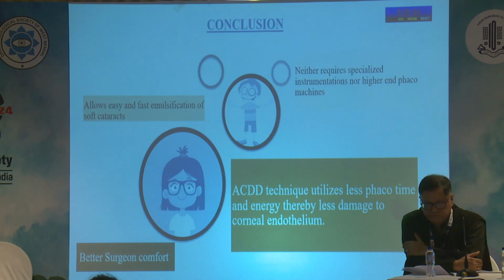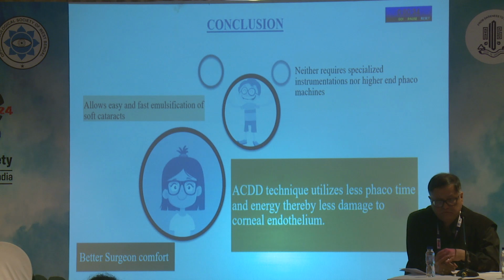To conclude, ACDD allows easy and fast emulsification of soft cataracts. It has better surgeon comfort. It neither requires specialized instruments nor higher-end phaco machines. It also utilizes less phaco time and energy, thereby causing less damage to the corneal endothelium.